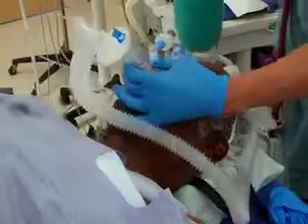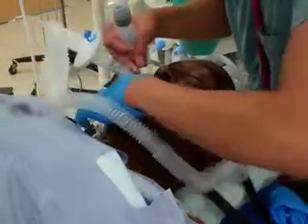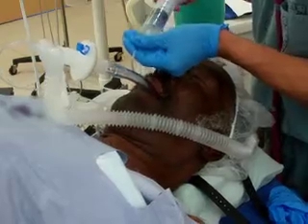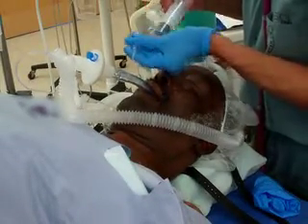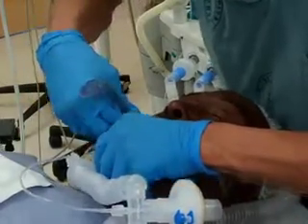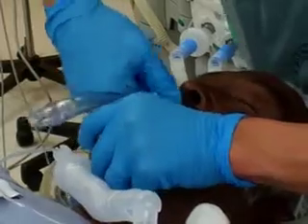Improper placement of the laryngeal mask airway can result in a poor seal or an obstruction of airflow. If air leaks from the mouth or you do not achieve adequate ventilation, add an additional 5 to 10 milliliters of air to the cuff. If additional air in the cuff fails to improve ventilation or decrease the air leak, then gently remove and reinsert the laryngeal mask airway. If ventilation is still not achieved or there is still a large leak of air from the mouth, attempt placement of a larger laryngeal mask airway.